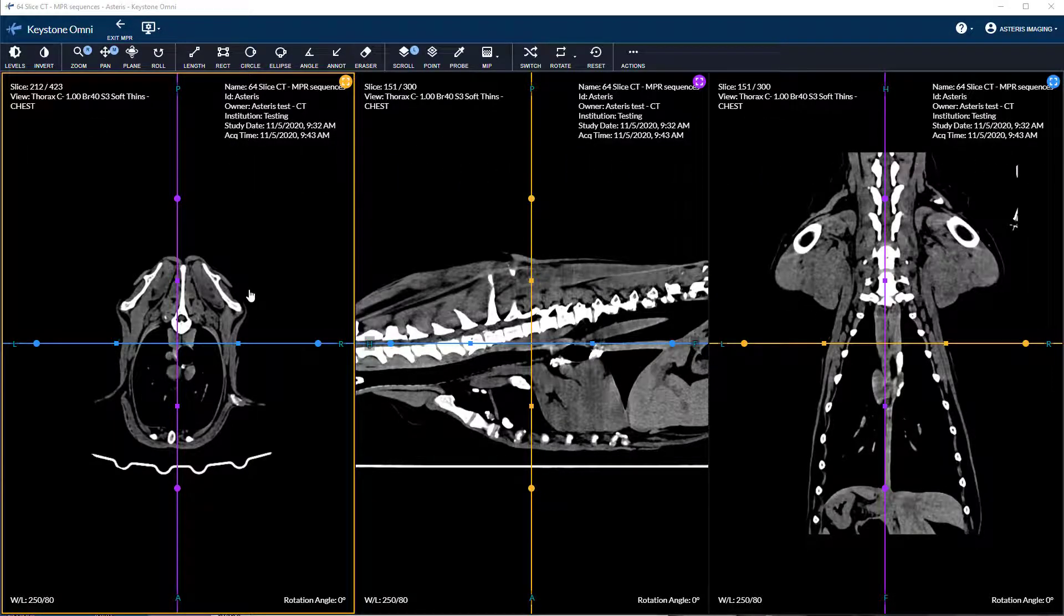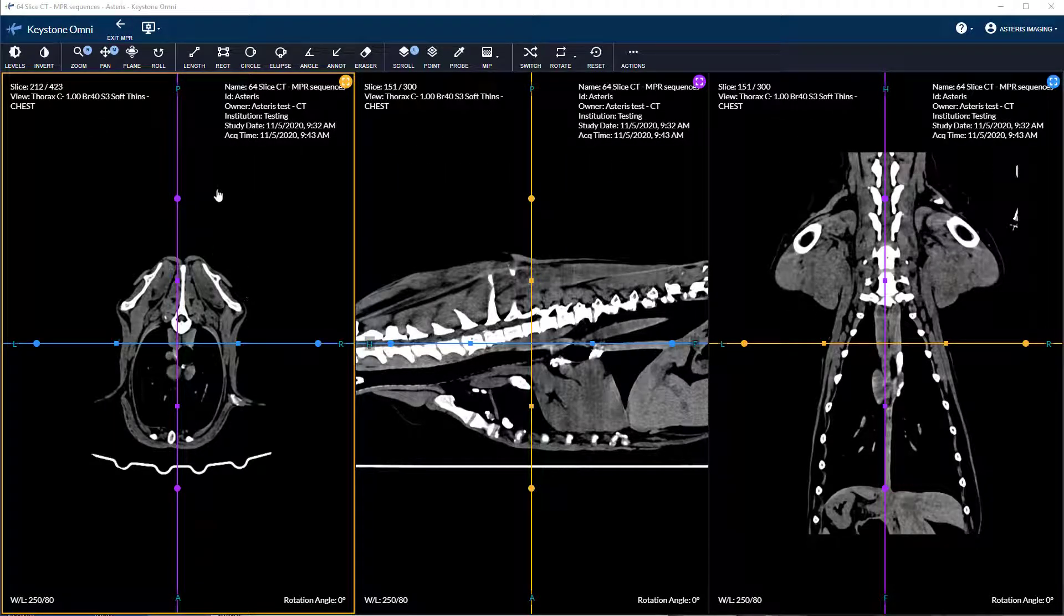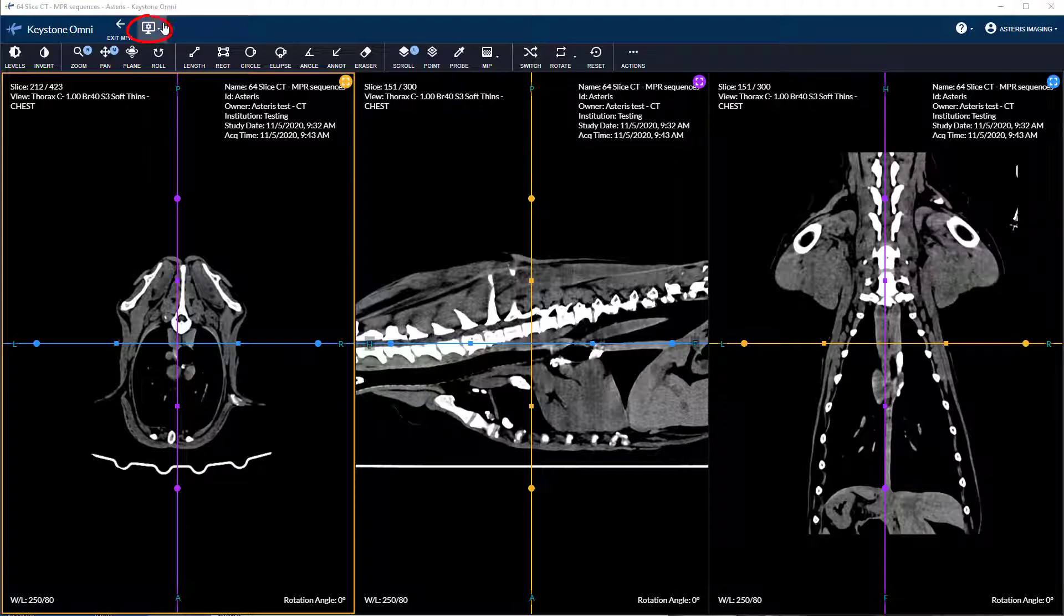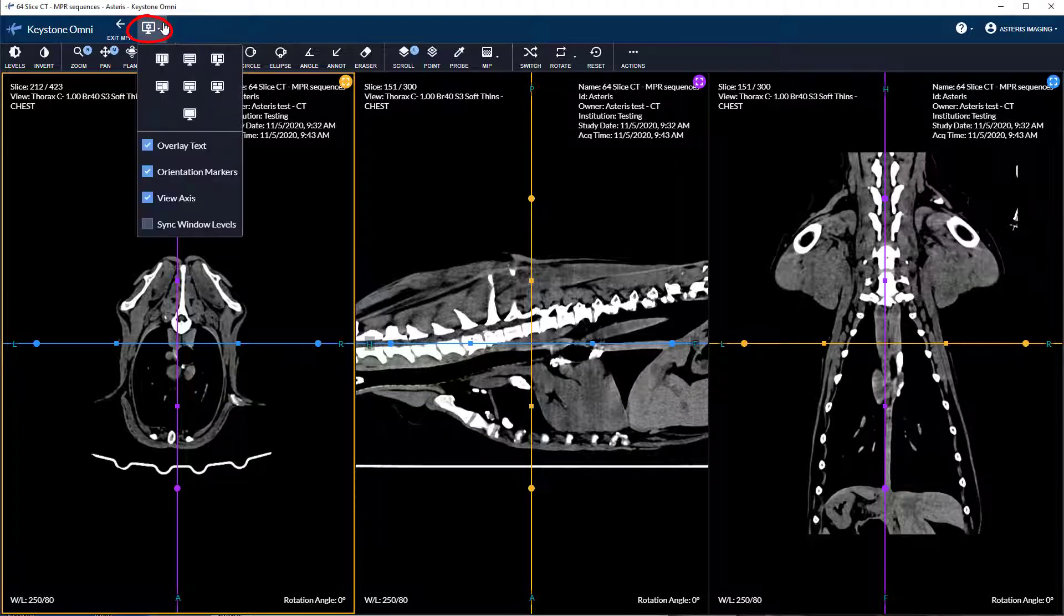You can modify the panes by selecting the viewer settings at the top left and adjusting the canvas to your liking.